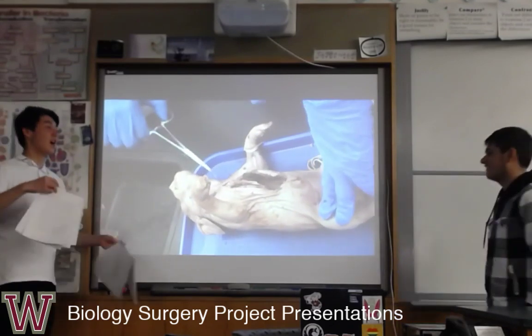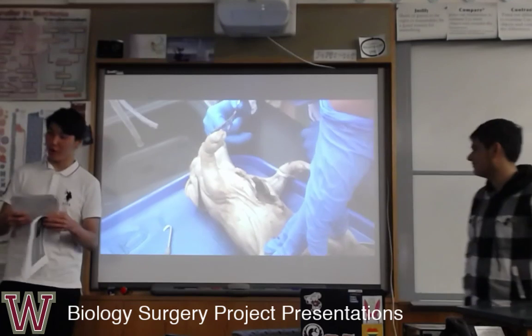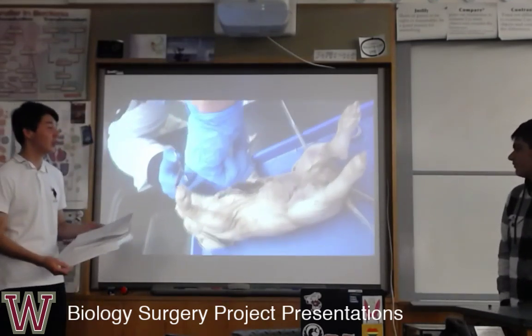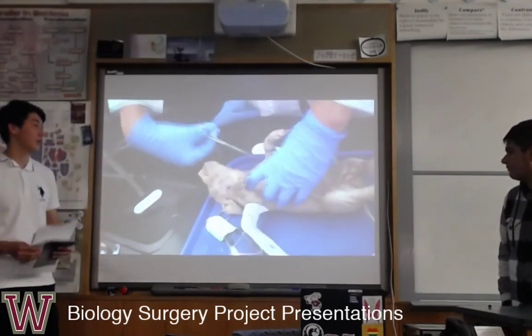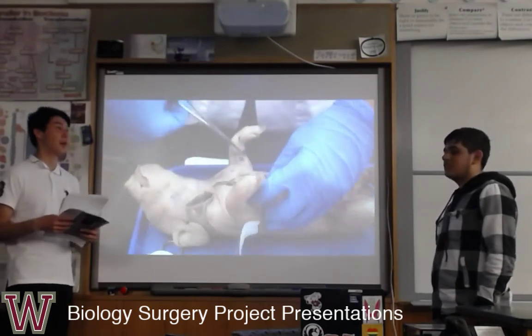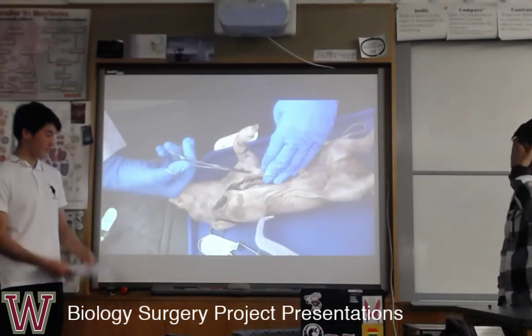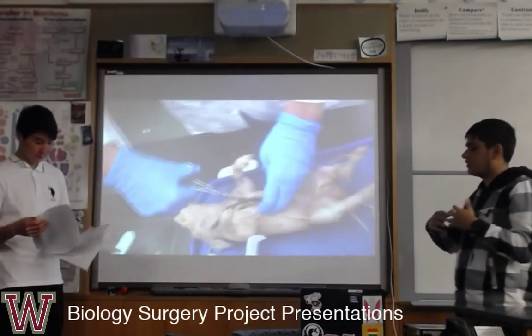The stitchings are made to dissolve in your body, so they don't have to be taken out of you. They dissolve together with your veins, and they make sure that your blood doesn't leak out of your new arteries that pump the blood out of the heart. So now we got the veins in. This is the part where we are trying to put together the chest bone.